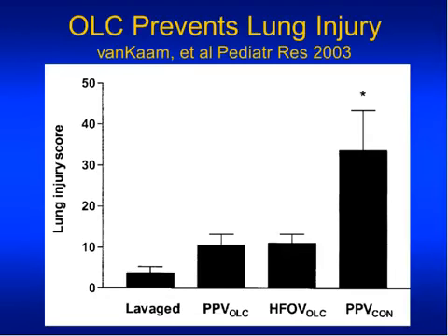So here's an old study that's actually now been published. We looked at a bunch of babies with meconium aspiration, thinking that these babies have a lot of air trapping, overexpansion, increased alveolar dead space, and that they probably need a bigger tidal volume, and they did. Substantially bigger tidal volume compared to similar-sized infants with more homogeneous disease.